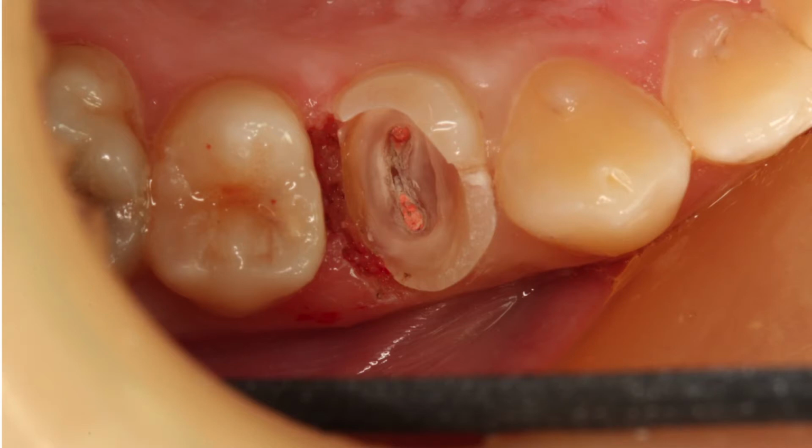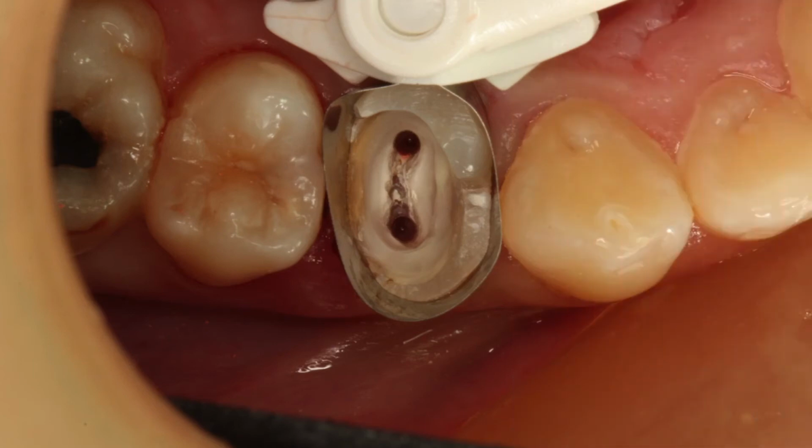Yeah. The diode is invaluable, and they're so inexpensive anymore. If you're going to ever find yourself working around implant abutments or screws, you can't use an electrosurge. They're a little slower than an electrosurge, but by the same token, they can be used everywhere, and they have a better hemostatic effect.